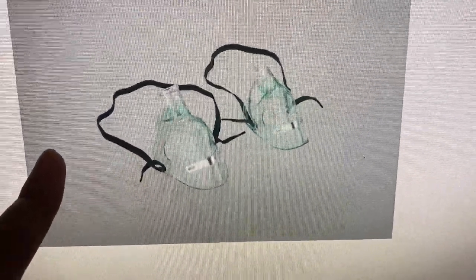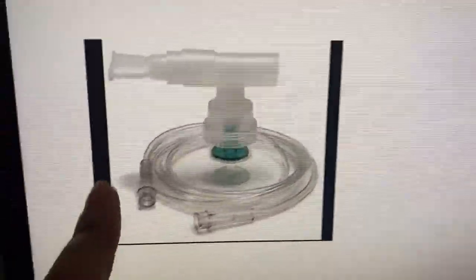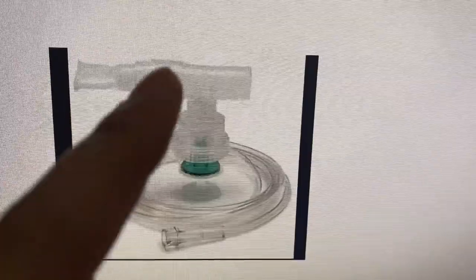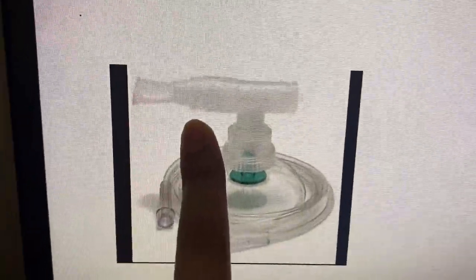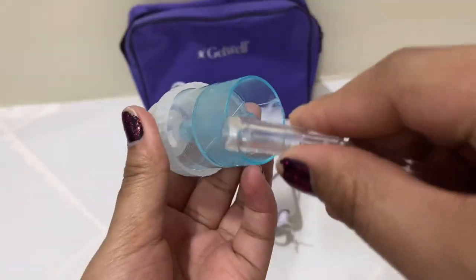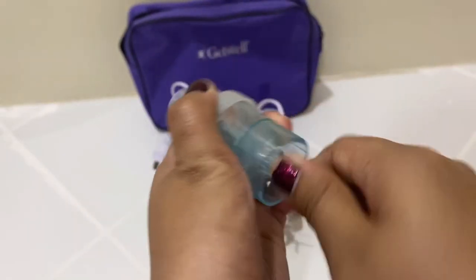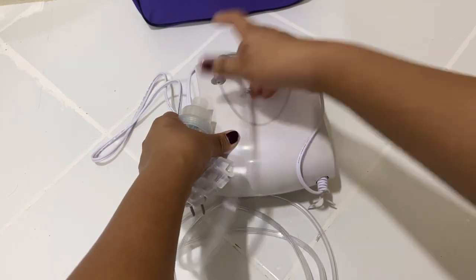the pang-adult. Ito yung hitsura ng mouthpiece niya. I think may iba't-ibang design ng mouthpiece, but this is the mouthpiece na usual na makikita ko sa ginagamit sa hospital. Ayan, yun yung tsura niya. So, connect the hose to your medicine cup or medicine bottle to your nebulizing machine.